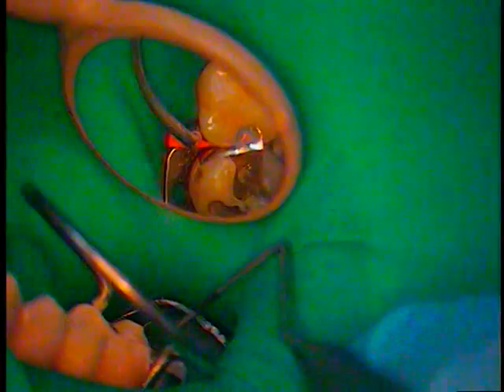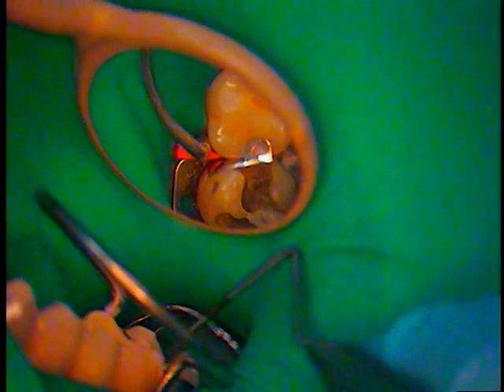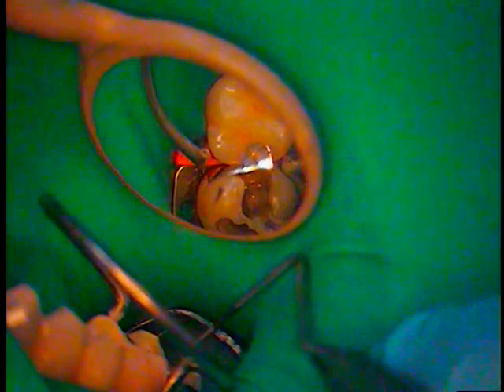Okay, this is a liner which doesn't need etch, not to be confused with other materials. I'm going to light cure it, takes 20 seconds to light cure. The liner's job is to insulate the dentinal layer that's closest to the pulp.